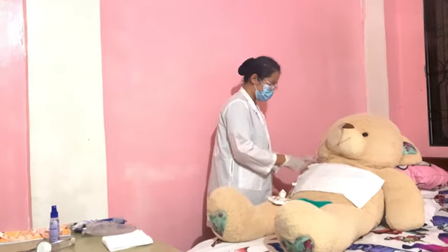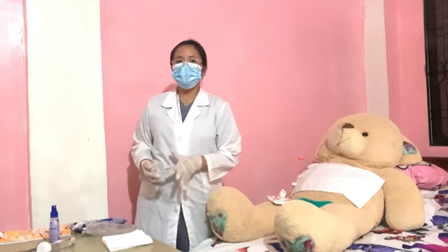Secured. And then, for additional support, the tube can be taped onto the patient's cheek using a piece of tape.